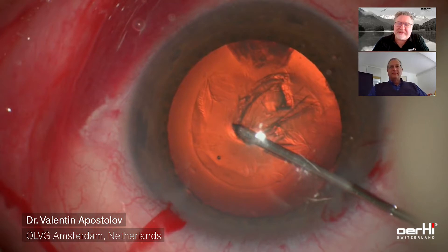Have you ever used our capsulotomy tip to do the capsulorexis? Yes, certainly. I have a couple of those and I enjoy using them in difficult cases — mostly when it's intumescent cataracts and I want to avoid running out of the capsulorexis, or if the anterior capsule is fibrosed like in hypermature cataracts. Also in some other operations like lens IOL exchange, it's very useful because one can make the opening of the capsule in any desired form and location. It gives a stable, quite strong edge of the capsulorexis.